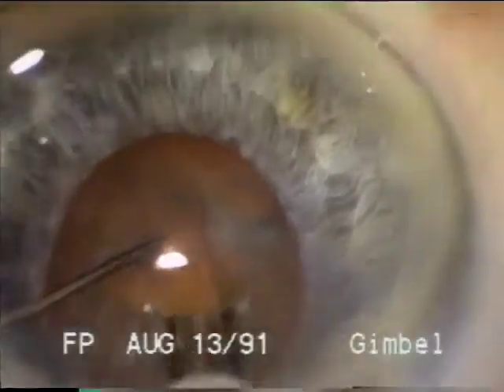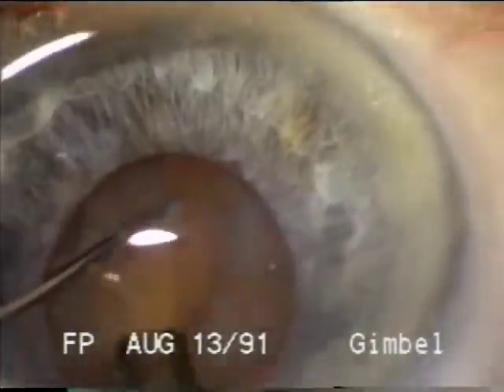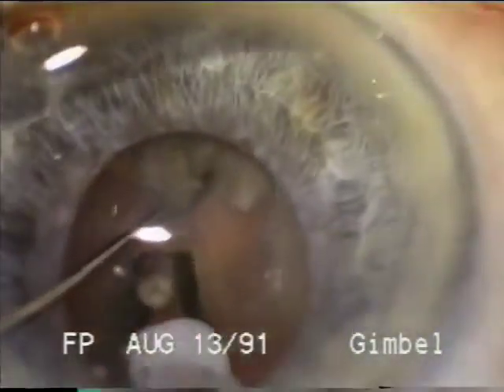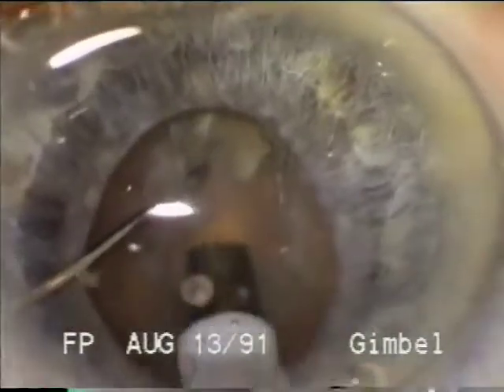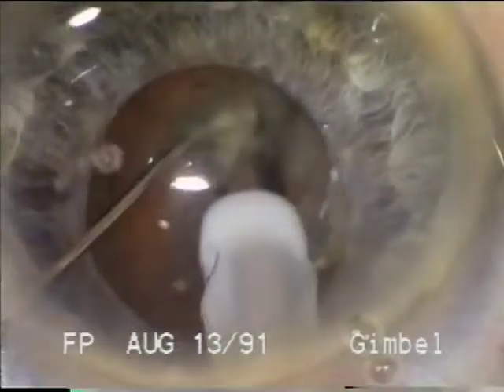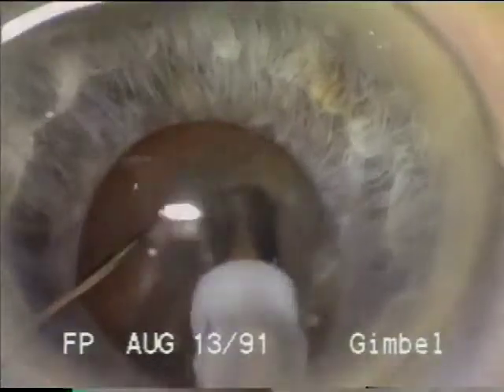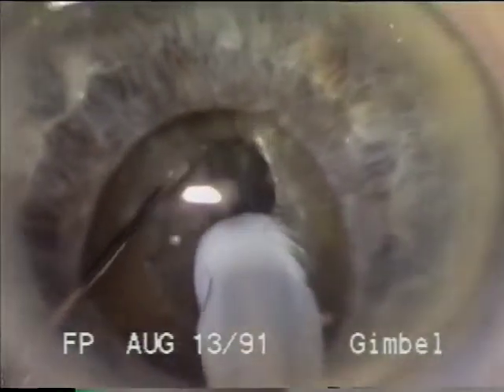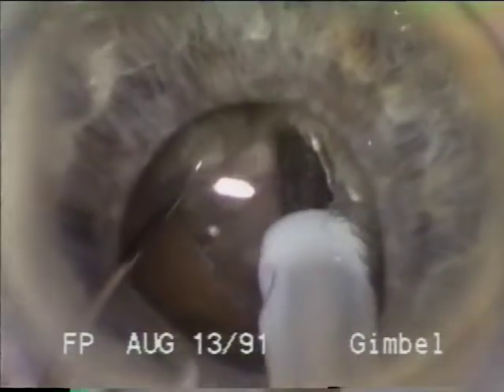We will now demonstrate these techniques in first a five millimeter pupil and then a two and a half millimeter pupil. Here you see the sculpting begun with the second instrument stabilizing. Hydrodissection is important in these cases so that the nucleus can be nudged inferiorly within the capsule and so that rotation can be easily accomplished. You see now the second instrument nudging the nucleus inferiorly. We're just past the center of the nucleus even though it is close to the iris.